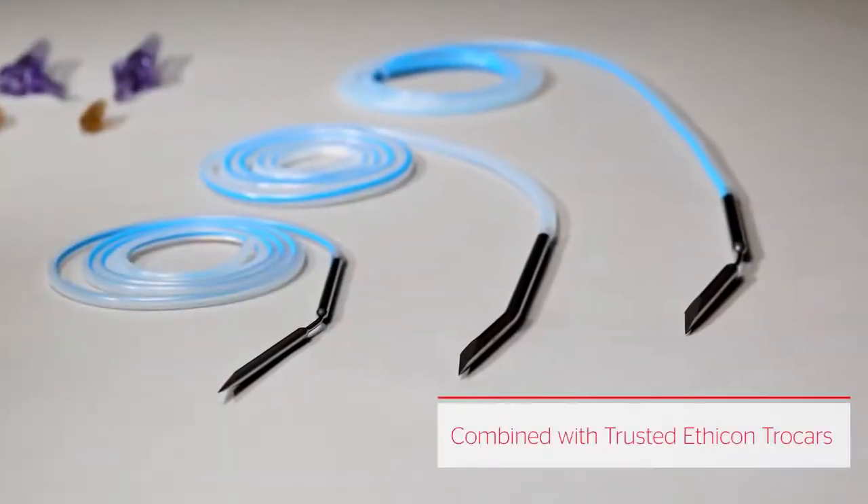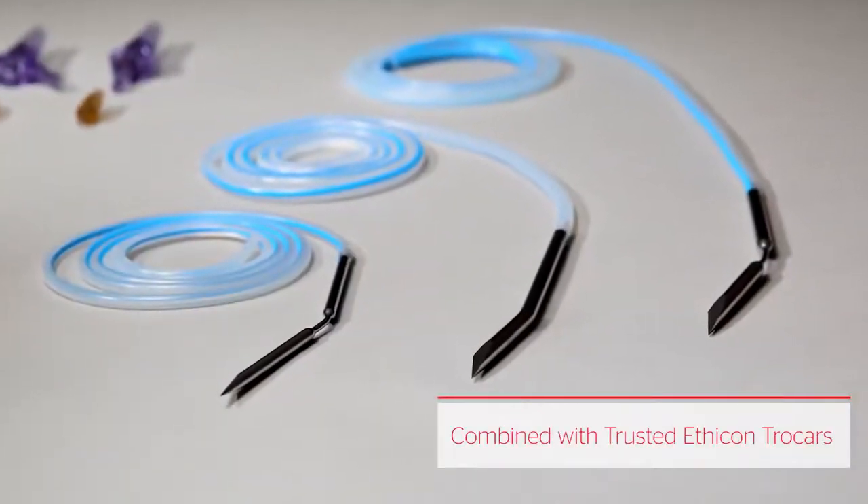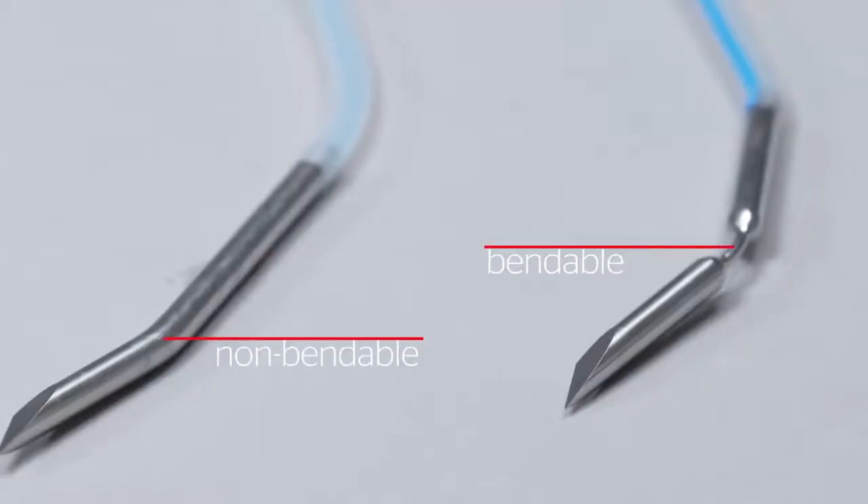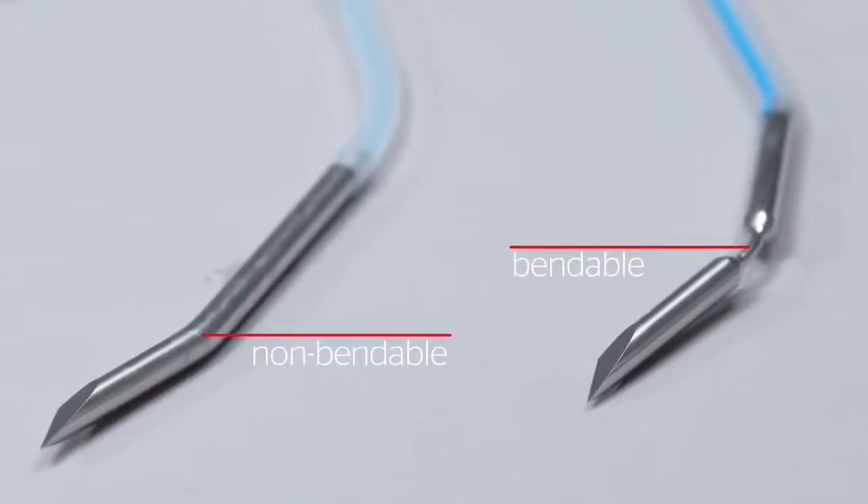The Blake drain portfolio includes a full range of quality Ethicon trocars in patented bendable and non-bendable varieties to facilitate easier placement.